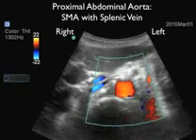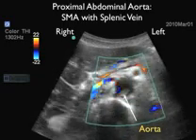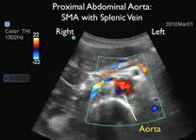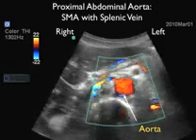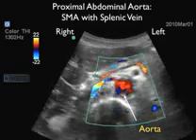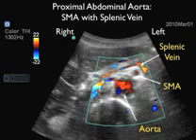This is a short axis view taken with Doppler sonography, looking specifically at the SMA. We see the aorta pulsating towards the posterior aspect of the image right above the spine, and here we can see the superior mesenteric artery coming off of the aorta right there. And notice that it has pulsations indicating good Doppler flow. So here we'll freeze that down, and we see the classic appearance of the SMA with its bright mantle and the splenic vein arching on top of the superior mesenteric artery.